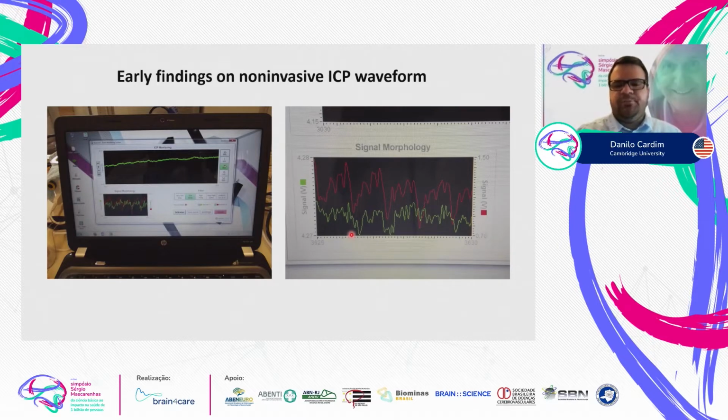sensor, the strain gauge. So as we see here, for example, in rats, we do have a little bit of difference concerning the waveforms. For example, here we do see these periodic larger oscillations that represent the respiratory rate of the rats. But inside this larger oscillation, we see small peaks that correspond to the intracranial pressure waveform.